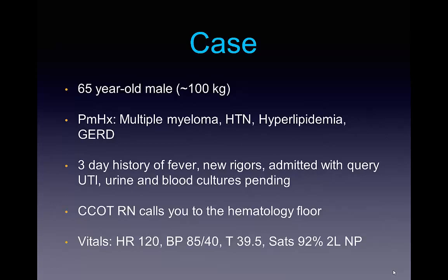With regards to oxygenation, you're going to perform with a high-flow nasal prong oxygen delivered underneath the mask. You're going to use a non-rebreather mask. If you need to have additional oxygenation or ventilation, a BVM could be used. The BVM breaths can be given with the patient's own breathing if they have some respiratory effort. At this point, you're also going to think about their positioning using ramp protocol.